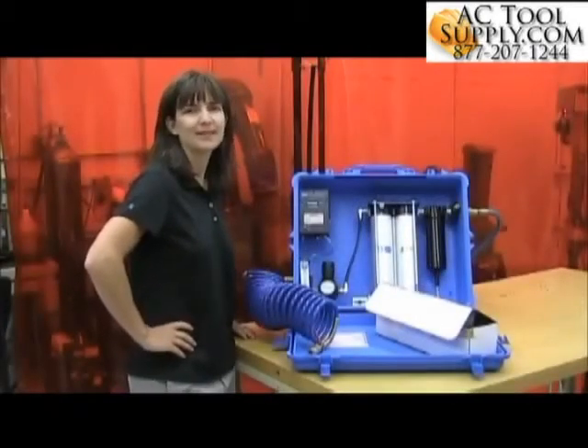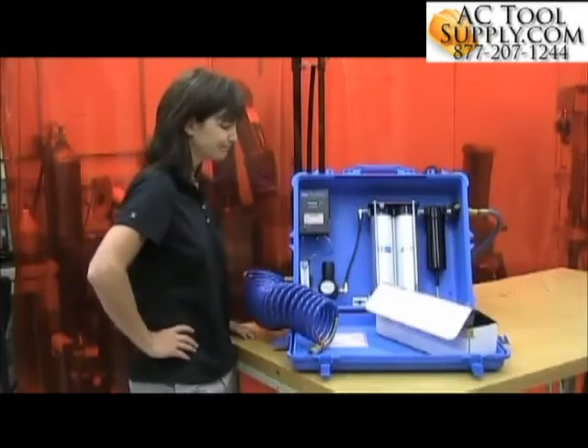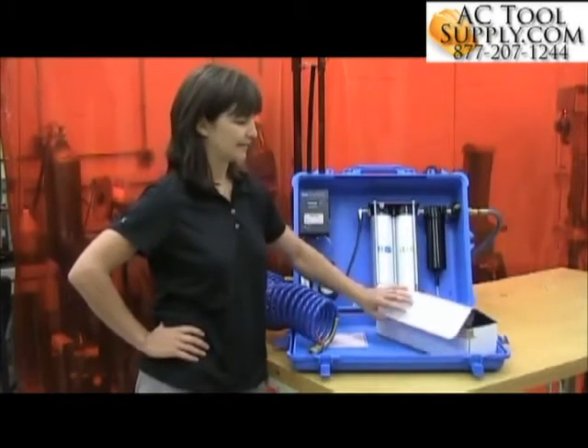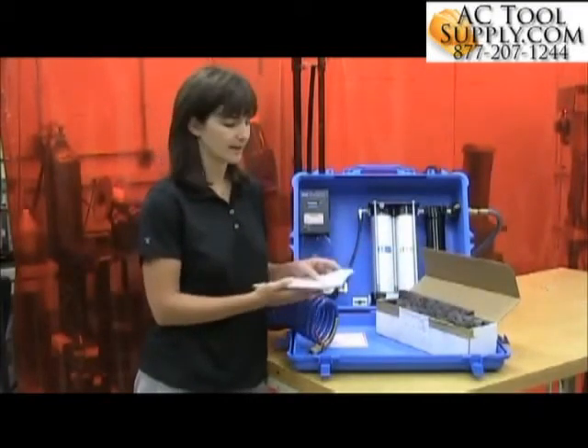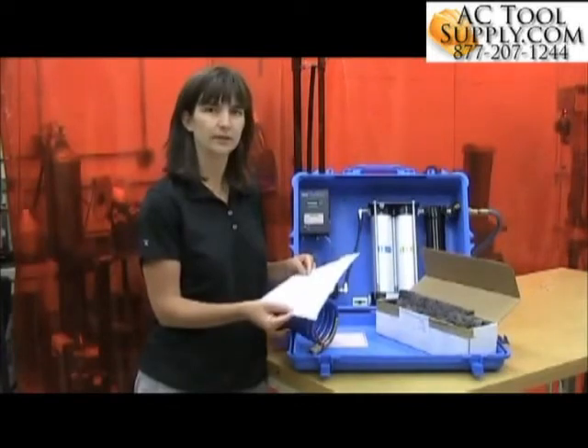Today, I'm going to show you one of the methods you can use to test for grade D breathing air. I've ordered an evacuated canister test kit and essentially you just have to follow the instructions that come along with the kit in order to test your supplied air system.